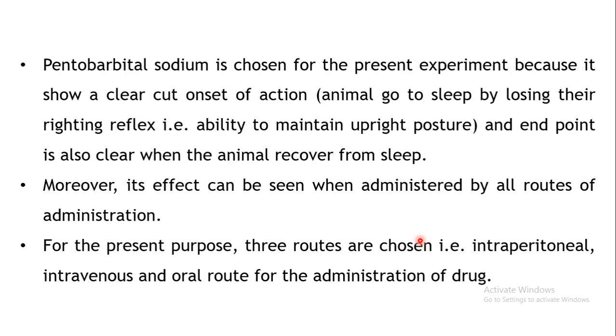Now, in this particular experiment, we have selected the drug pentobarbital sodium. It's a barbiturate basically. These were quite popularly used earlier as sedative hypnotics, to calm down the patient as well as to induce sleep. It belongs to the barbiturate class. But since benzodiazepines came into the picture, phenobarbital, pentobarbital, butobarbital, these types of drugs have almost gone out of use. So for this experimental purpose, we are going to use pentobarbital sodium.